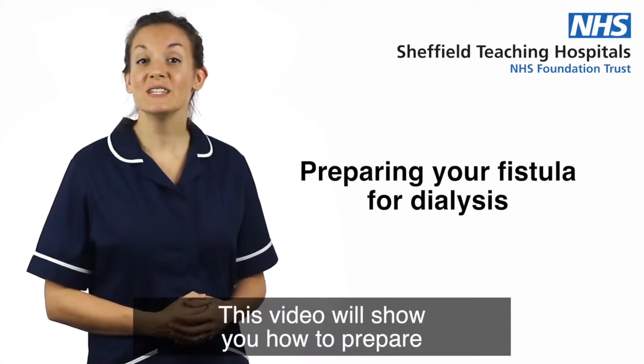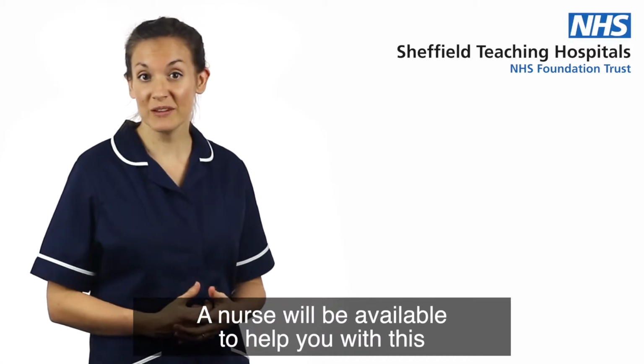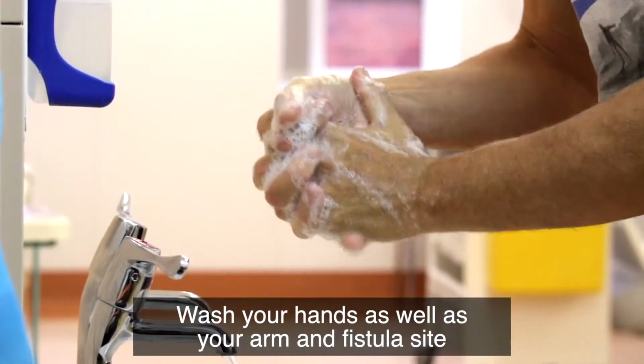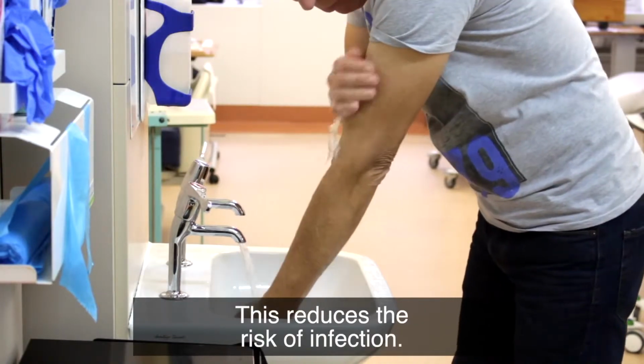Hello. This video will show you how to prepare your fistula for dialysis. A nurse will be available to help you with this, as you may need an extra pair of hands. Wash your hands as well as your arm and fistula site thoroughly with soap and water. This reduces the risk of infection.